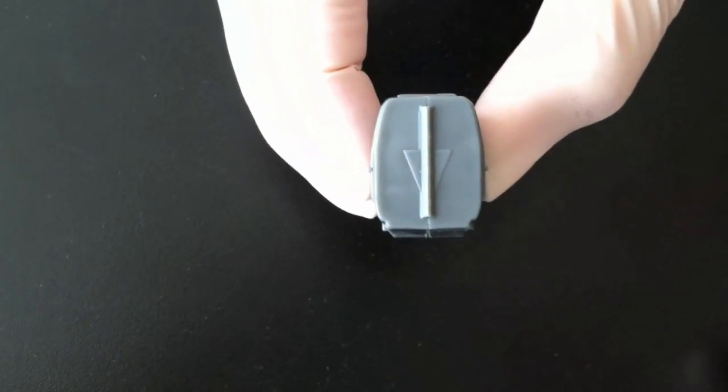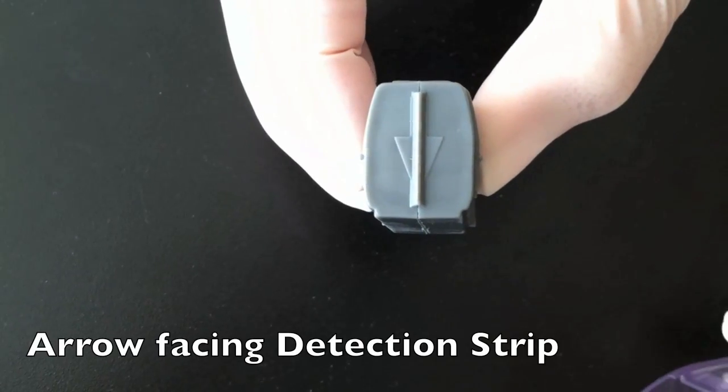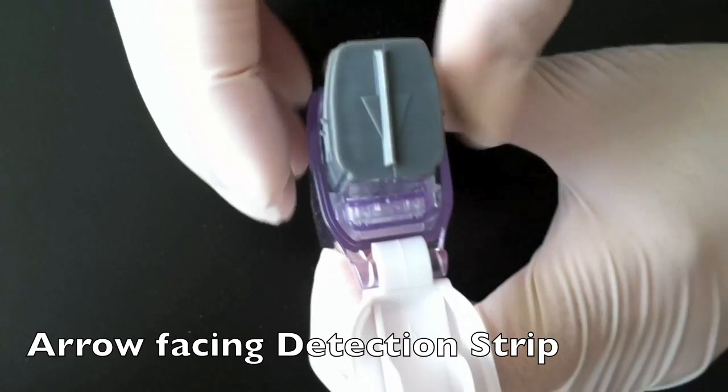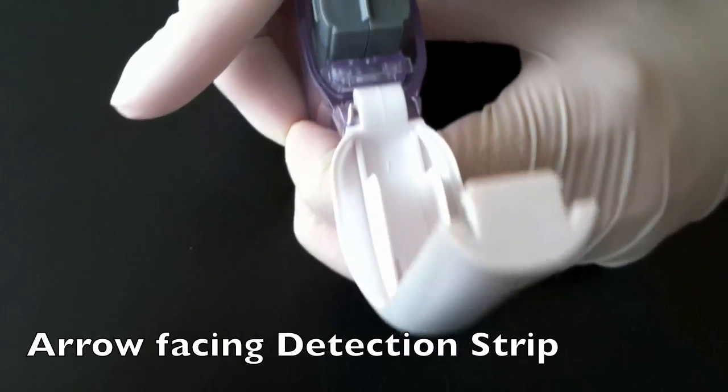Insert the closed amplicon cartridge into the detection chamber. Make sure the arrow located on the top of the amplicon cartridge faces the detection strip.